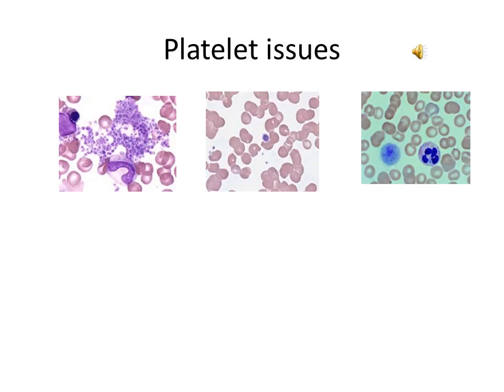It's important when looking at platelets that you don't go along the periphery of the smear. That tends to be where platelets will clump together, and that's not a true picture of platelets. If you see on the left-hand side, that's a picture of a platelet clump. It's important to make note of those because they may actually cause the automated machine to read the platelets as lower than they actually are. When you get a lot of platelet clumps like that, you need to get a blue top tube to correct that issue.